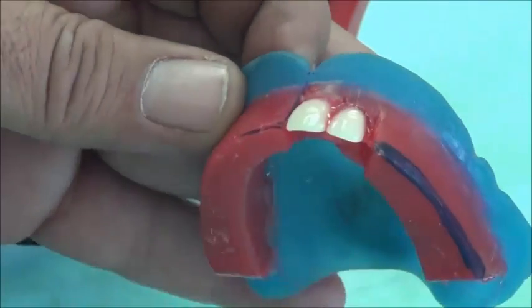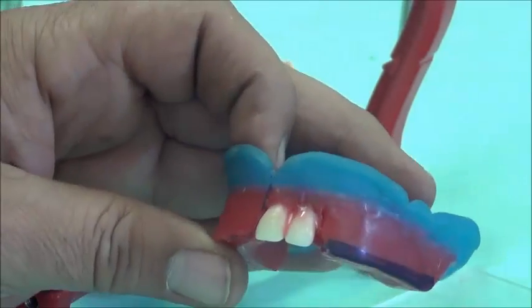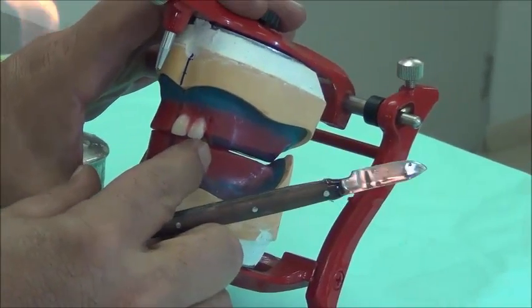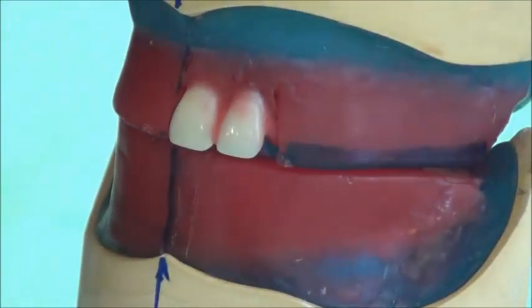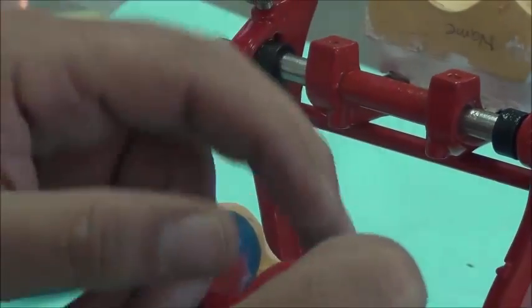Once we finalize the lateral incisor's position, we begin fixing it. If more wax is needed, we bring it from an outside source, and molten wax is spread around the tooth. We put it back and make sure we are still on the same arch. We confirm the overjet with the lower is still clear, and that the tooth is in correct location. Now we go for the canine.